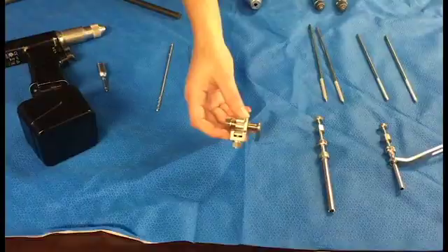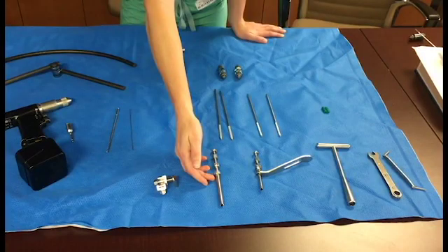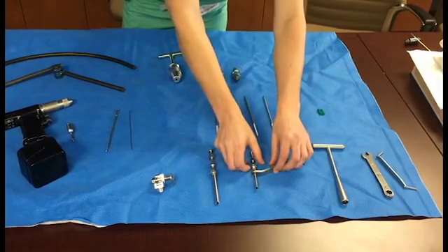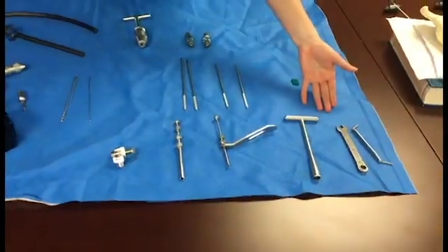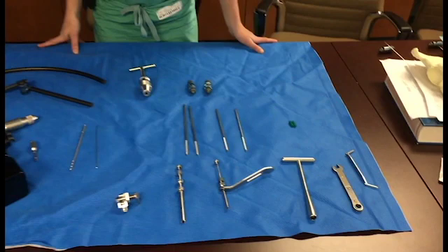A compression-distraction device allows compression especially for APC-type injuries, as in the case we will be showing today. We have the 4mm guide wire drill bit which is used for the 6.0 Schanz pins. We also have the triple sleeve guide, which screws in to allow for more stability and control while advancing the K wire and the Schanz pins. Here we have your standard tightening devices as well as two pin covers for the pelvic external fixator.